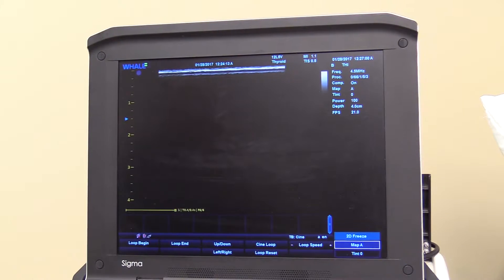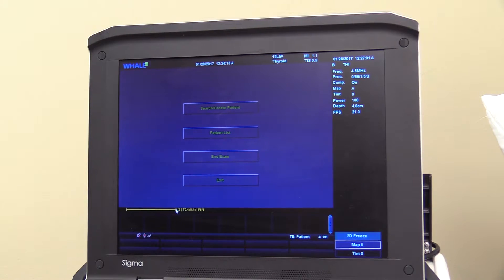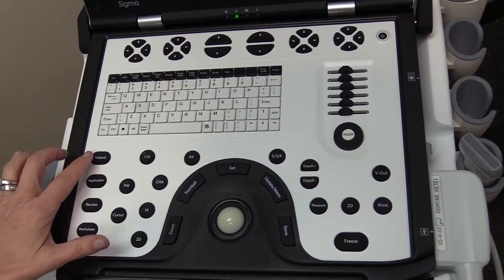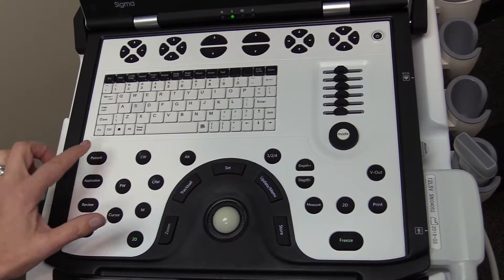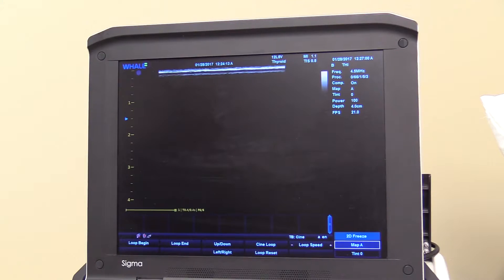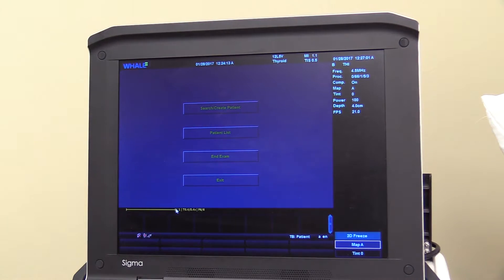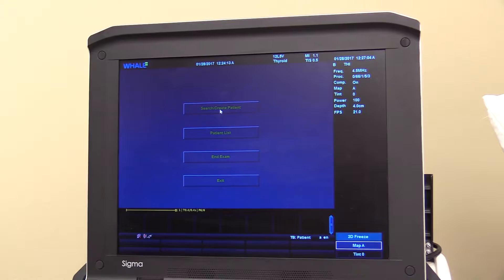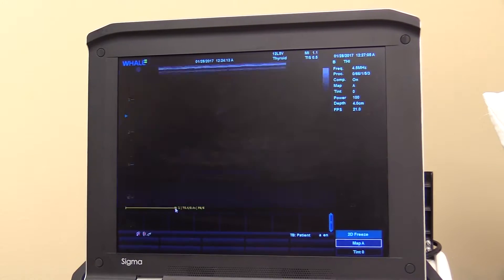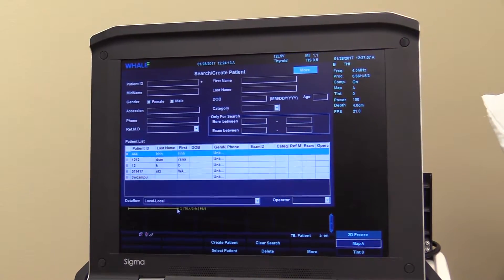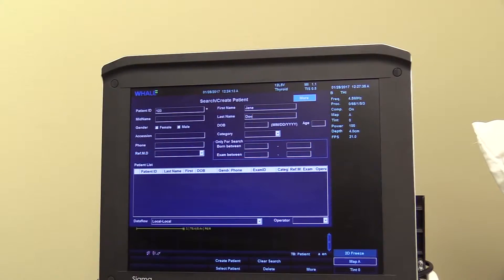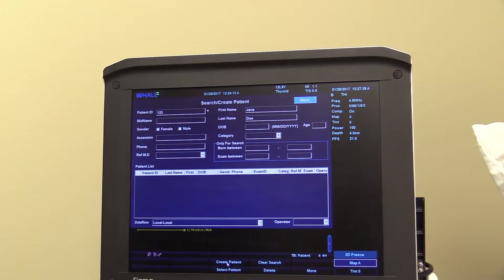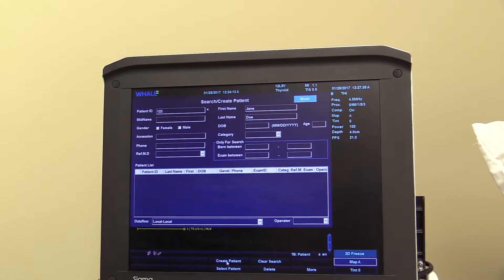Prior to beginning the exam, enter patient data. Press the Patient button to create a new patient. Select Search, then Create Patient. Enter the patient's ID number and patient name. Once the information is entered, select Create Patient.